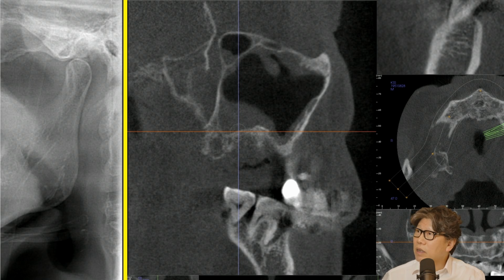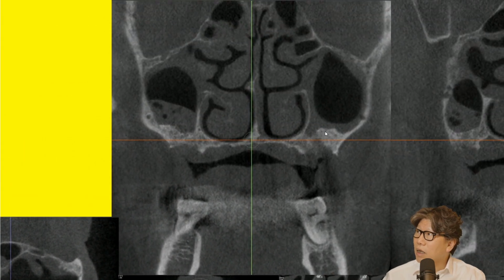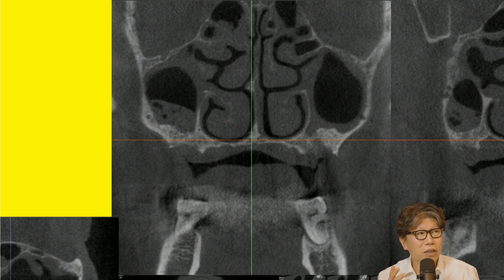And then, if you look at the sinus, there's some bone left because we did a bone graft through the sinus lateral window before. If you see here, this is where I used BioOSS, and there's quite a bit left. When you're planting, you're thinking, well, maybe if I use the palatal bone and the lateral side of the nasal cavity, I'm not going to get a good fixture fixation. I think we've lost the palatal bone here, and I'd like to use a little bit of the lateral side of the nasal cavity here as well.